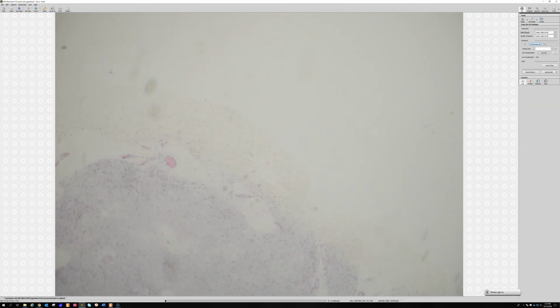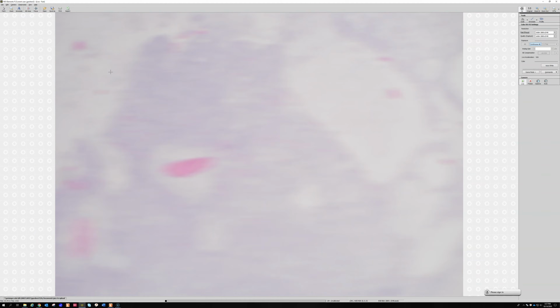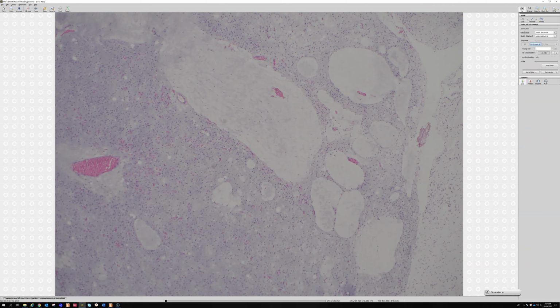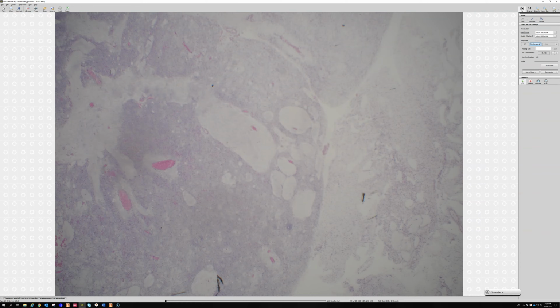And also, one other thing I'll point out is this. See these pockets, these pools of no cellularity with myxoid stuff in them? Sometimes myxoid liposarcoma does this. It makes these pools of myxoid background, which are almost totally empty of cells. Some people have likened this, when there's a whole bunch of this, to alveoli filled with fluid. They call this the pulmonary edema pattern. It's a little bit reminiscent of what an autopsy lung with pulmonary edema looks like. So that's helpful to think of when you see this.